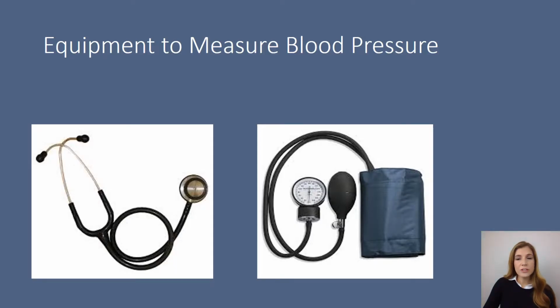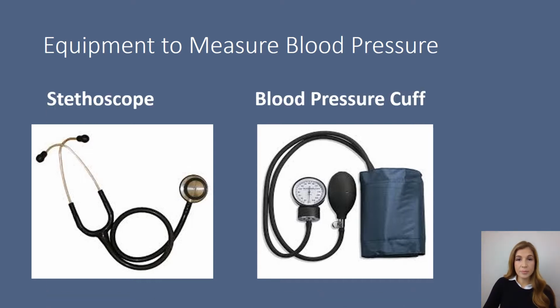So the equipment that you'll need to use to measure blood pressure is going to be a stethoscope and of course a blood pressure cuff.